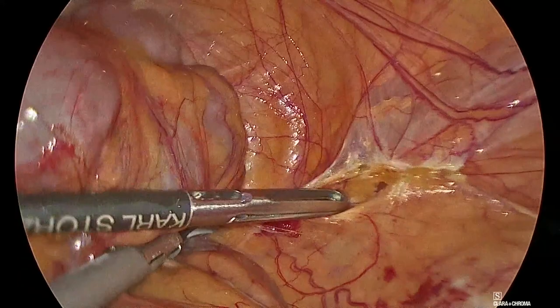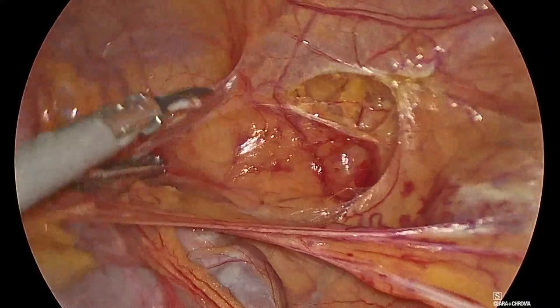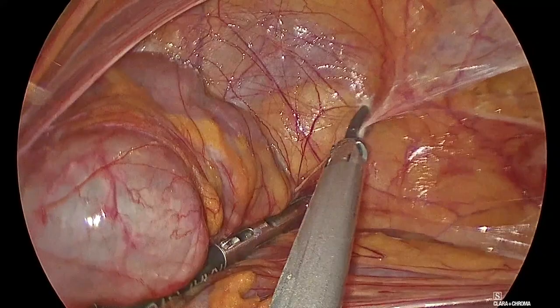So you see, we are dropping the colon. So now we just drop the colon. Let's go up here.